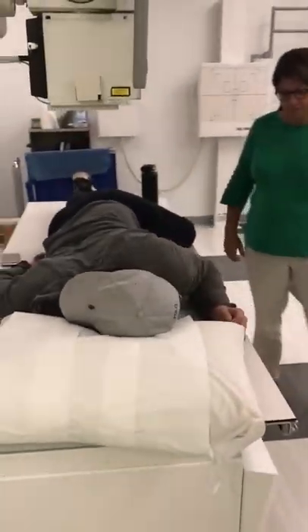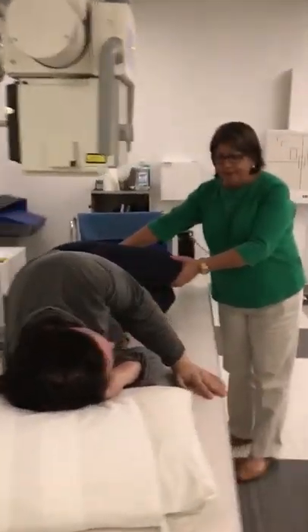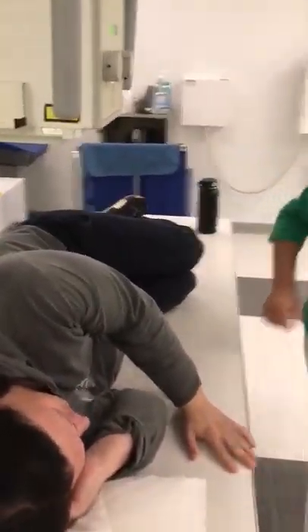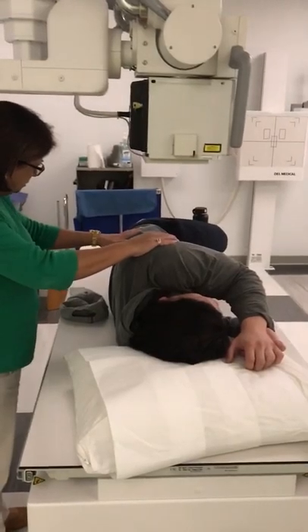Right side. I want the knees flexed for stability. Bring your arms up, kind of like you're praying. Again, we want to make sure that our patient is straight on the table and centered on the table. Please move your hips forward, sir. There you go.